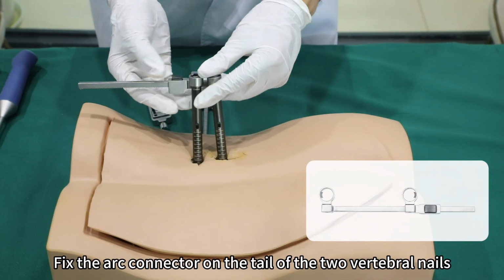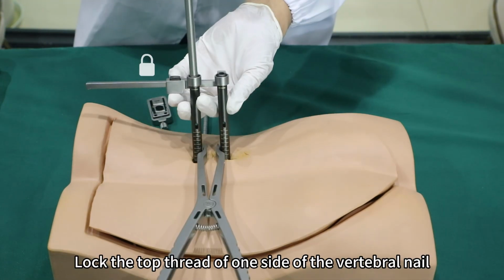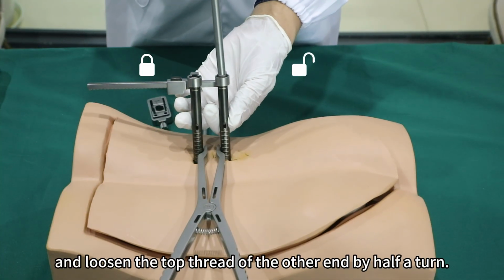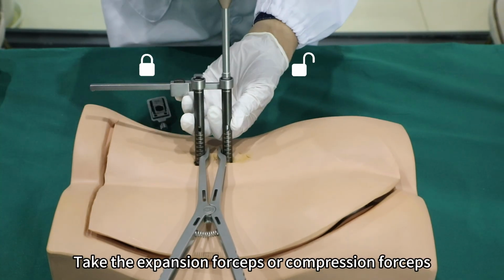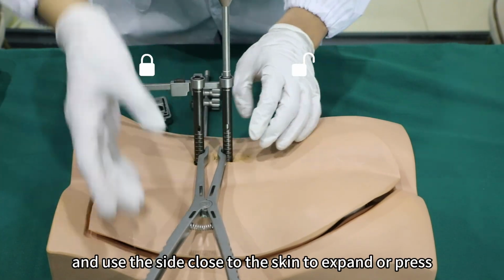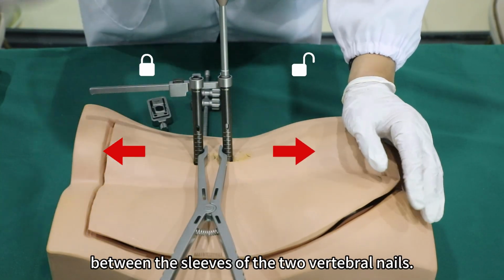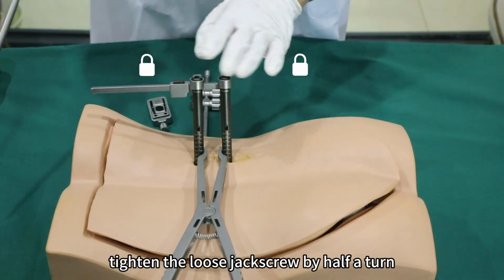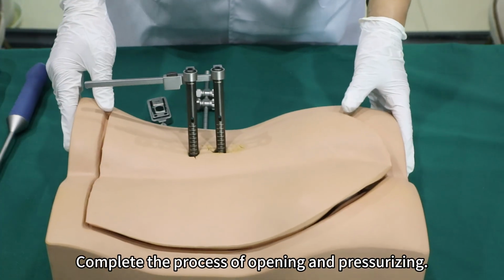Fix the arc connector on the tail of the 2 vertebral nails that need to be stretched. Lock the jack screw of one side of the vertebral nail and loosen the jack screw of the other end by half a turn. Take the expansion forceps or compression forceps and use the side close to the skin to expand or press between the sleeves of the 2 vertebral nails. When the ideal position is reached, tighten the loose jack screw by half a turn. Complete the process of opening and pressurizing.